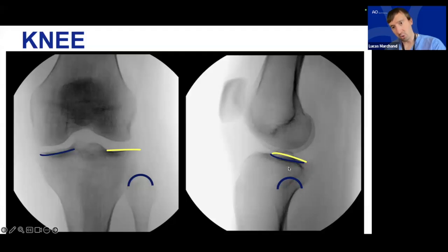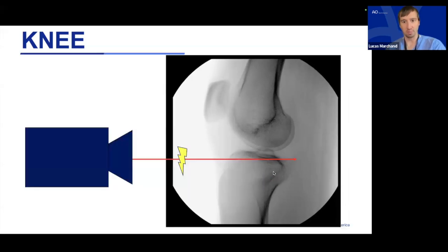And then on the lateral, as Dr. Stephenson had highlighted for us, the lateral plateau is convex, meaning it juts up, and the medial plateau is concave, meaning it juts down relative to the shaft of the tibia. And so you can actually see those shadows separately on a lateral and independently identify them on injury films and on intraoperative fluoroscopy when you're performing surgical reconstruction of a fracture.